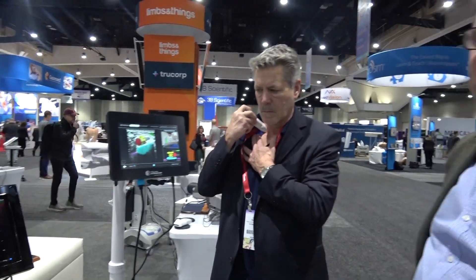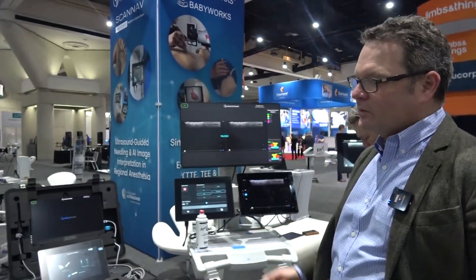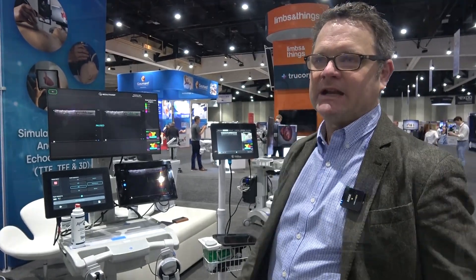We've also used the same classroom-to-clinic philosophy in obstetrics. Over there, for example, we've got our obstetric simulator which teaches ultrasound, and we've also incorporated our AI onto GE's ultrasound machines — in all of the Voluson ultrasound machines there's our AI as Sonalist, doing the same thing: taking the student from classroom to clinic.